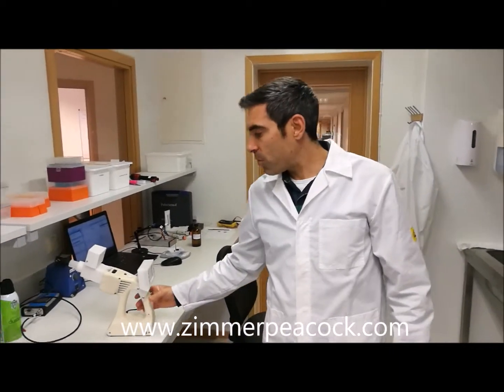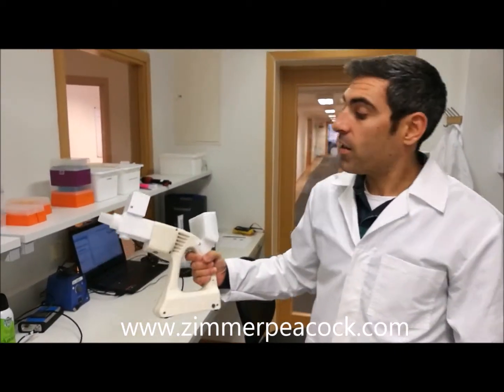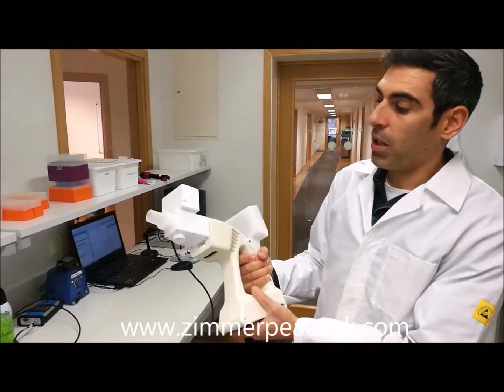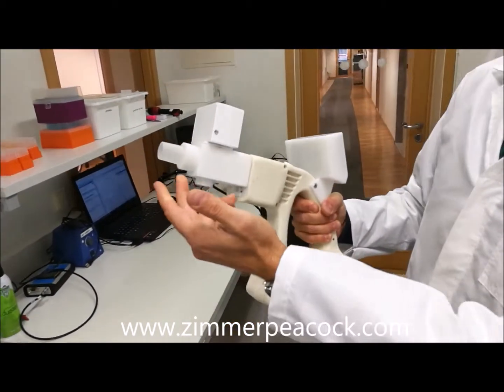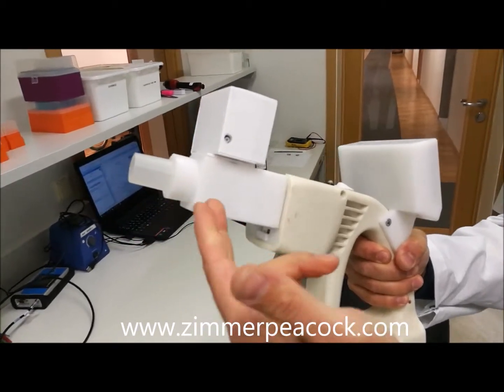Hello, my name is Andrea Fernandez, I'm a scientist at Zimmer Peacock. I'm here today to demonstrate our breath collection system, developed by Zimmer Peacock. It's a handheld device where you have a mouthpiece.